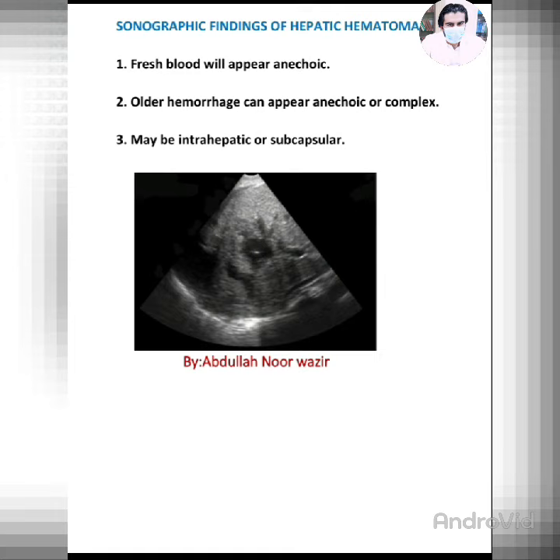Third, a hepatic hematoma may appear intrahepatic, I mean in the liver parenchyma, or subcapsular, below the liver capsule or hepatic capsule, during sonographic examination.